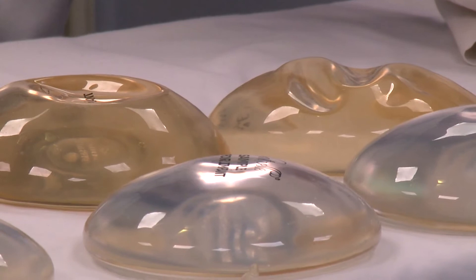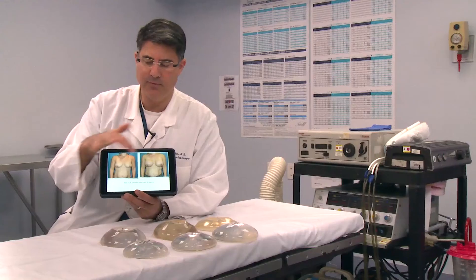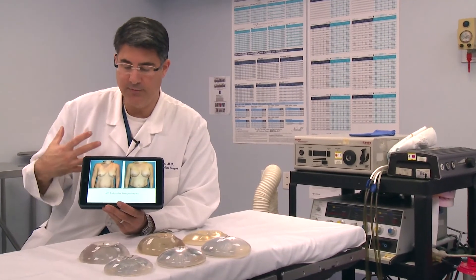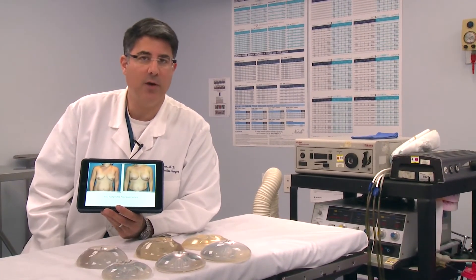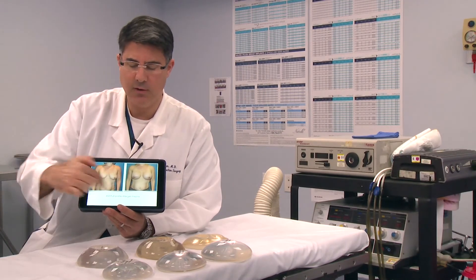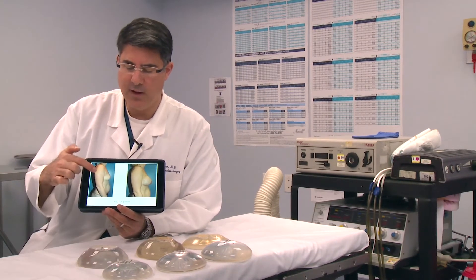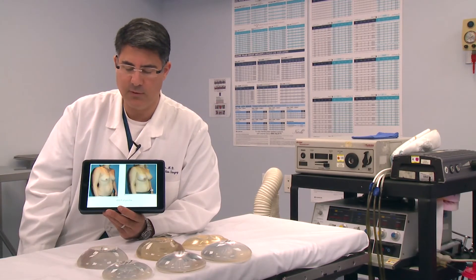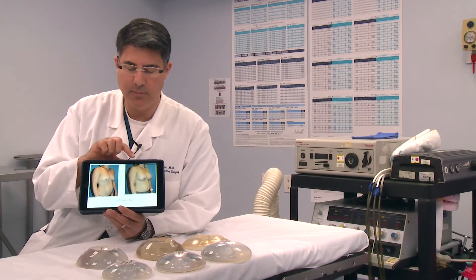Someone like this who's a mom — here's an example of a before and after that I recently did. This is a 450, more of a fuller profile. These implants come in a moderate, full, or extra full profile. This is a mother of two — this is the same patient, but the lateral view, before and after, two months after the surgery. And here she is again from the oblique view.